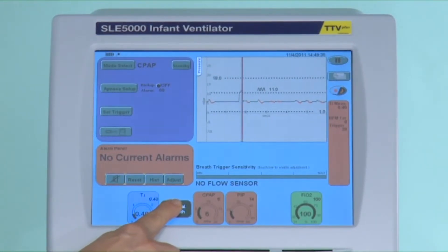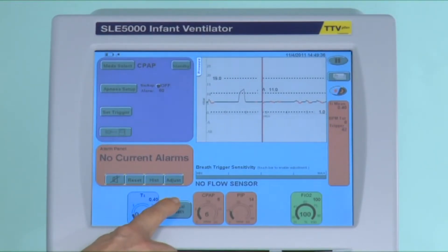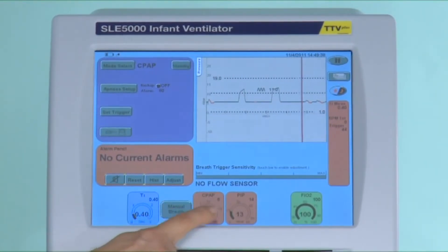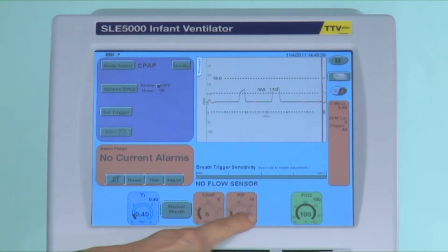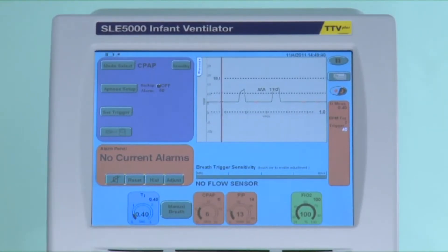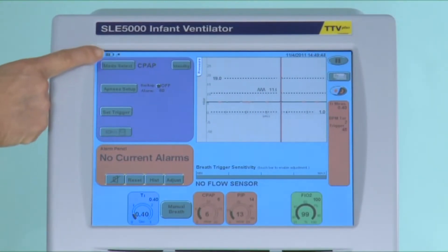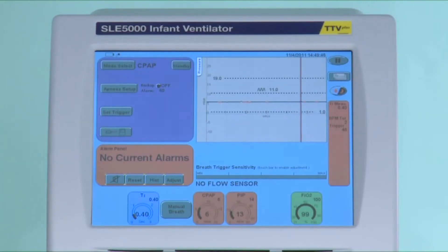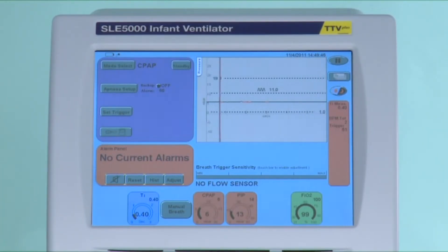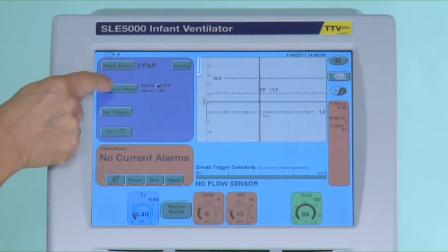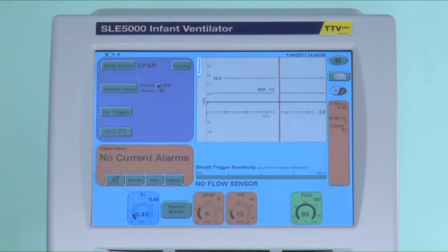By pressing the manual breath button you are able to deliver breaths at the pressure parameters that you have set. When you're in the mode and you've confirmed the mode, you have other options available, and one of them is the apnea setup mode.